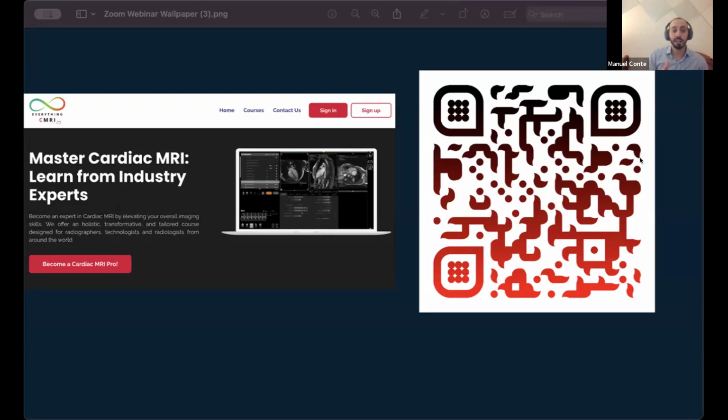But just keep in mind, if you increase the VAT, the images are more blurred. The acquisition time doesn't change, but the images are more blurred. So you need to be very careful and just remember that the VAT reduces the in-plane distortions. So the answer is 40-60% for titanium, and you increase more in case of cobalt and other materials.